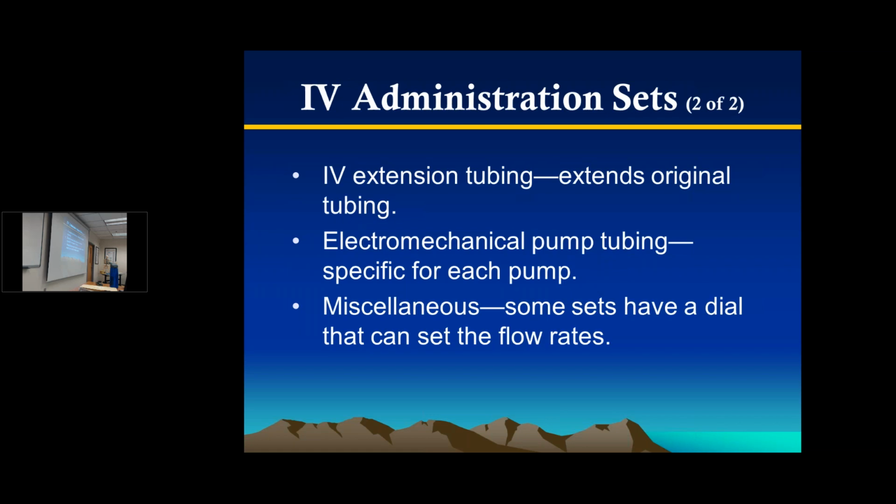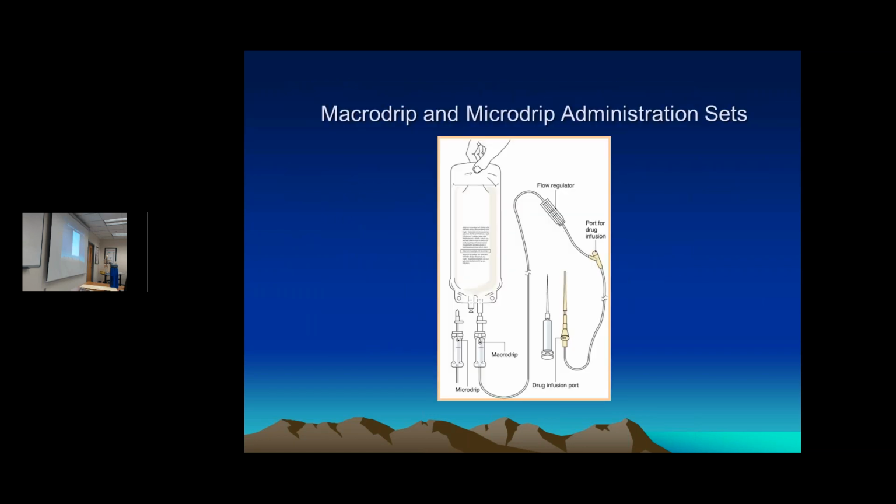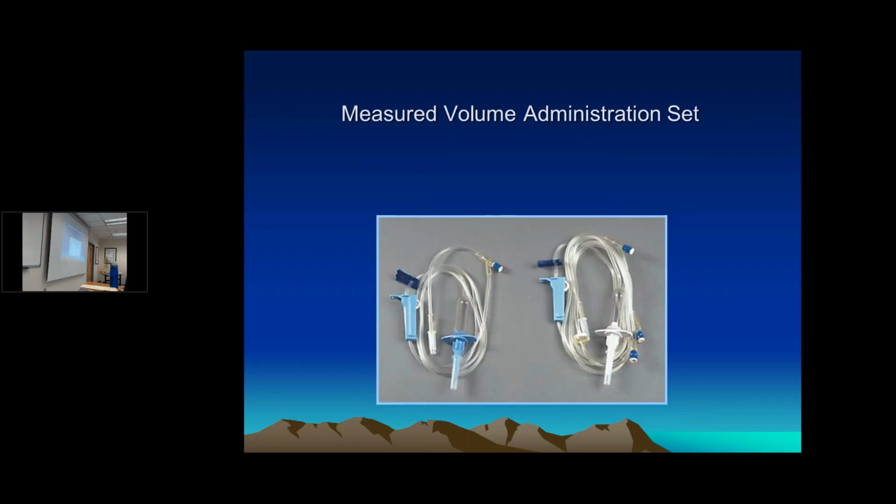And so the nice thing about it is pediatrics. The nice thing about it is if you want to run a specific amount, if you mix a bag and you want to run a specific amount in here, it'll be really handy in terms of using it. So many of you will not carry it, but it's out there. It's another nice to have as far as being fluid restricted on the way. If you end up doing interfacility transport, you might end up using a pump for that, but generally not so much. And that's exactly what we just got finished talking about in terms of administration sets and everything else. Macro versus micro.